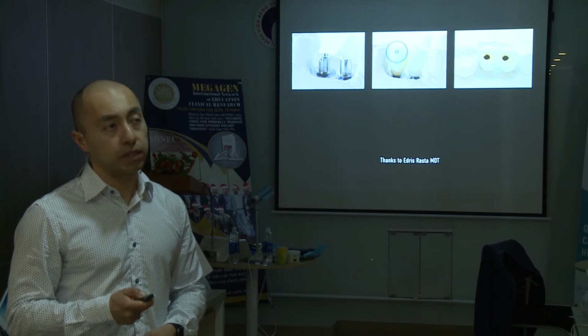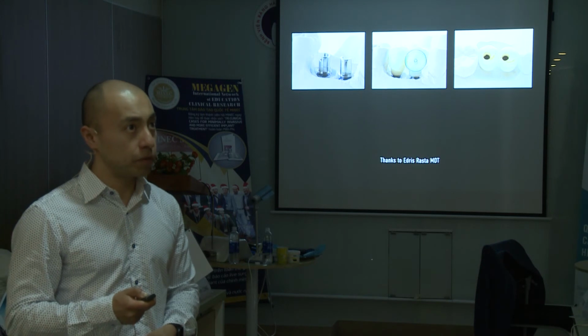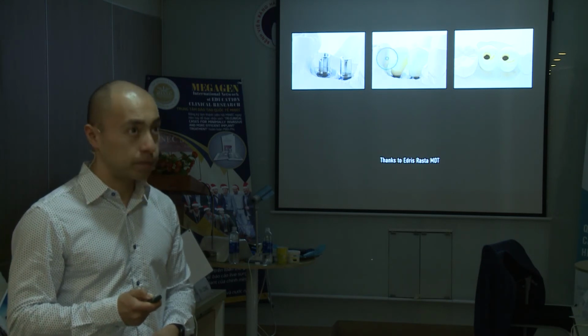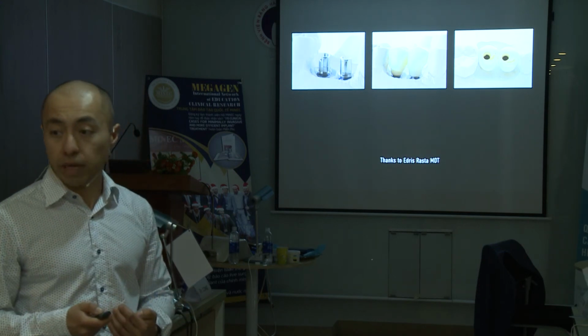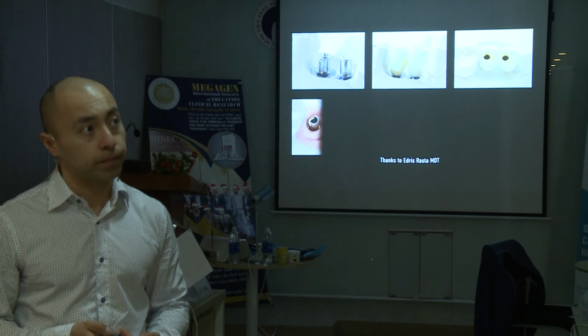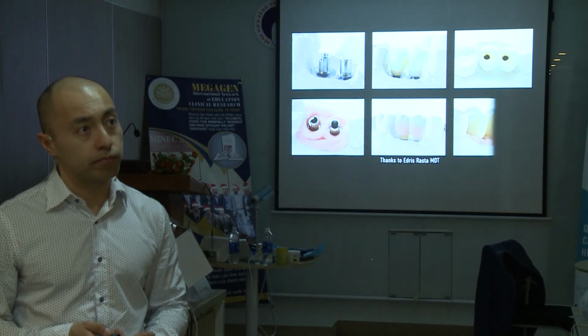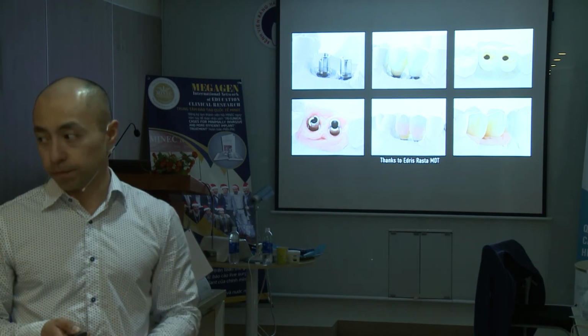What material is this? This is full zirconia crown. This is the strongest material we have now. This is unbreakable. But it's not that beautiful.